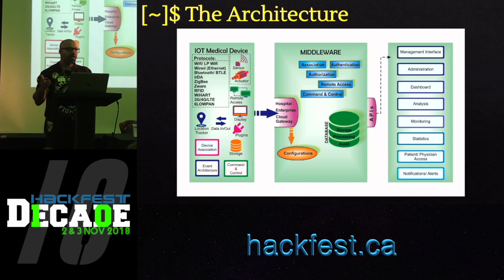Then there's middleware, and you can think of middleware as the application server for your medical device, and that has most of the logic for authentication, authorization, remote access, and so on. But the most important part of middleware is going to be the storage, processing, and audit, the data storage part of it, because that module takes or aggregates data from all these different medical devices and then outputs consumable data, which then can be fed into different kinds of portals.